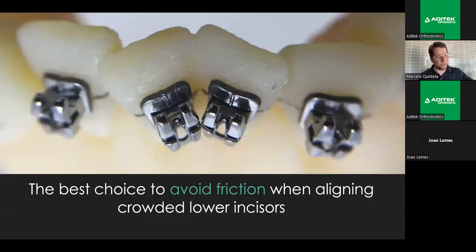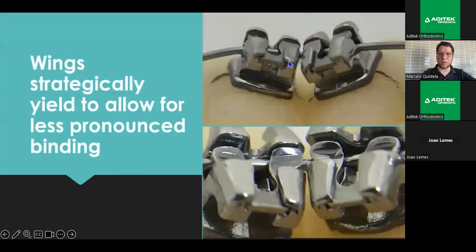Another thing, an observation, please pay attention. The best choice to avoid friction when aligning crowded lower incisors is the EasyClip. EasyClip can be better than other self-ligating brackets, including Damon. Why? Because its wings are strategically designed to allow less pronounced binding. These wings can move separately, strategically, to avoid a strong friction.